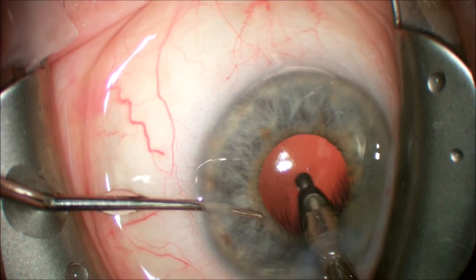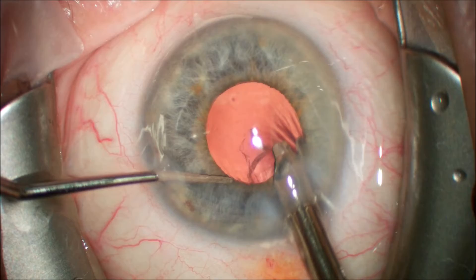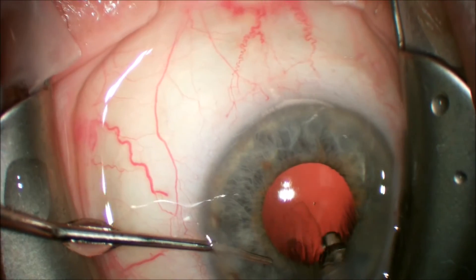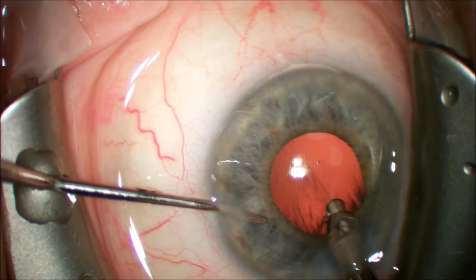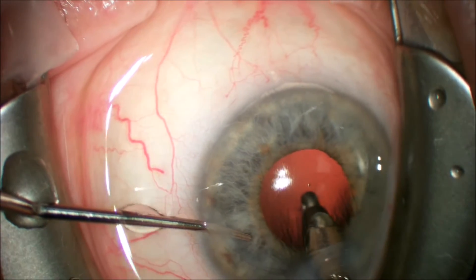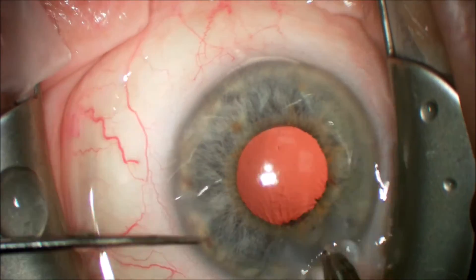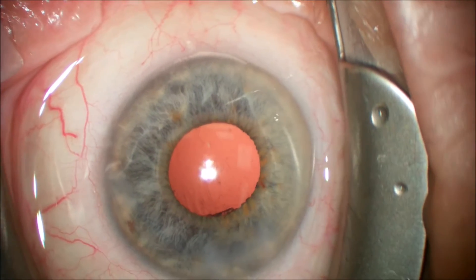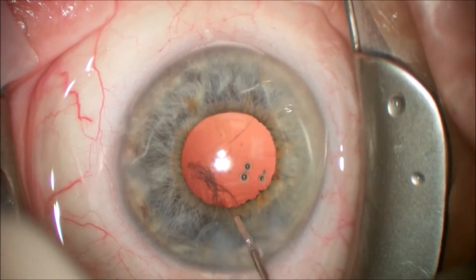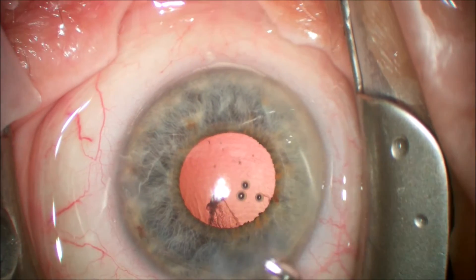It is somewhat difficult to remove the sub-incisional cortex. It is important not to struggle in this area but to use a cannula with balanced salt solution to power wash the central remnants of the cortex off the posterior capsule, and these can be removed after the intraocular lens implant is placed in the capsular bag.